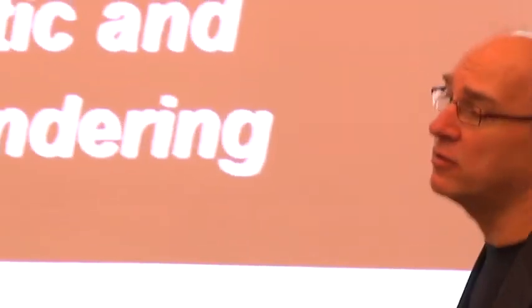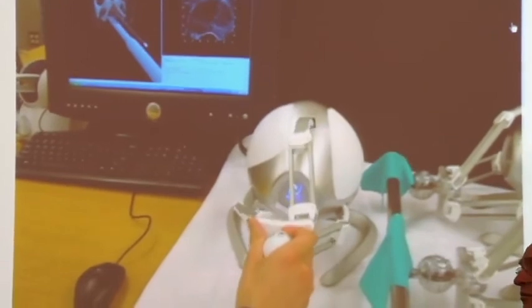The answer is yes. We want to use this as a training tool. Right now, this procedure is taught to a resident by the radiation oncologist standing next to him or her and saying, push higher, maybe reach behind it. This needle is too high. You're not fully registered with the ultrasound transducer, all of that. So we'd like to eliminate that as a training system.